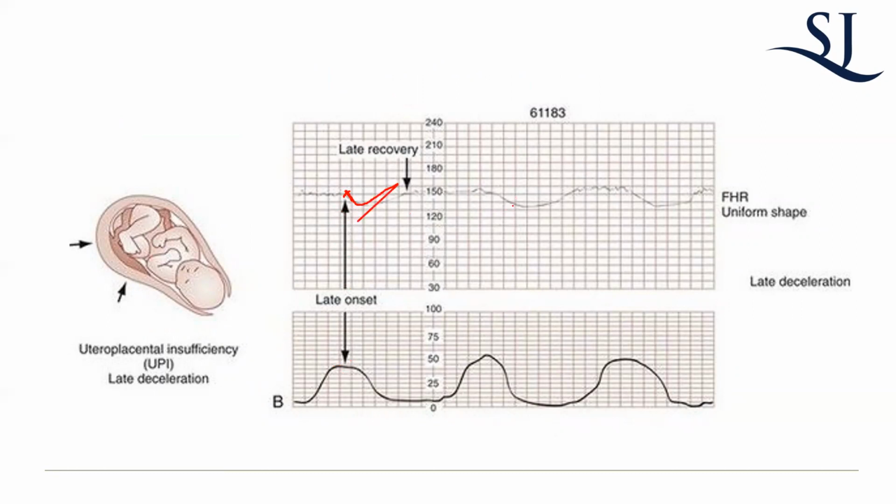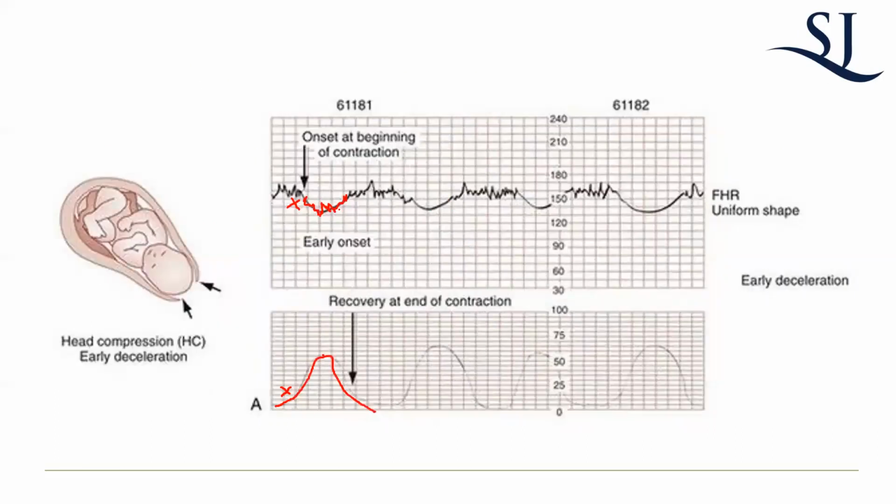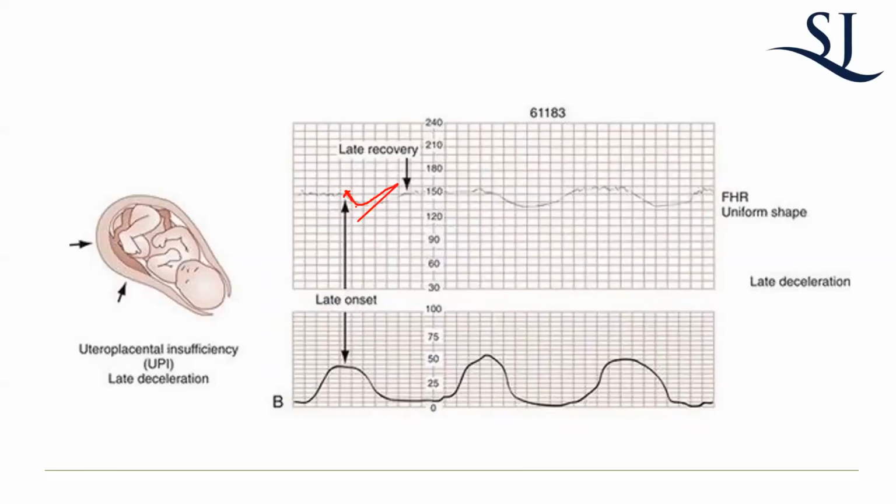And then you have, and keep in mind that your early decelerations and your late decelerations are generally not very deep, meaning they don't go down very much on the monitor. It's not 100%, but a common rule you could think of is that when you see a deceleration that has a very big dip to it, kind of like a bucket, you're probably dealing with a variable deceleration, which I'll get into. It's not 100%, you know. But you'll see these examples when it's like this.